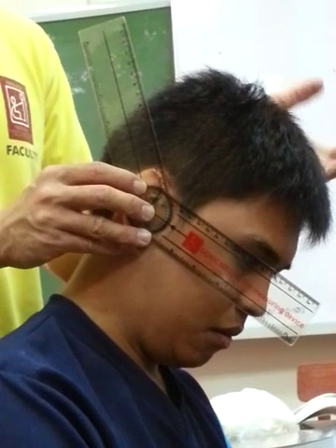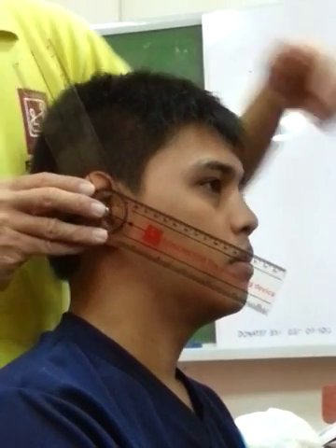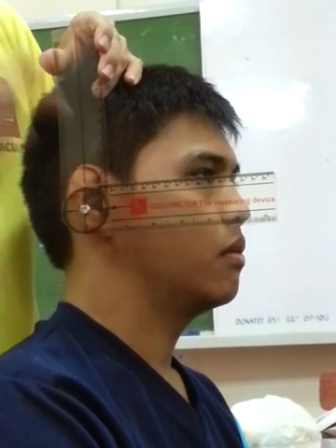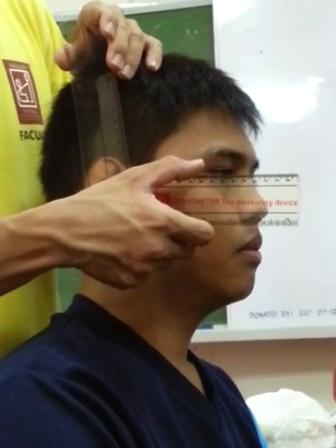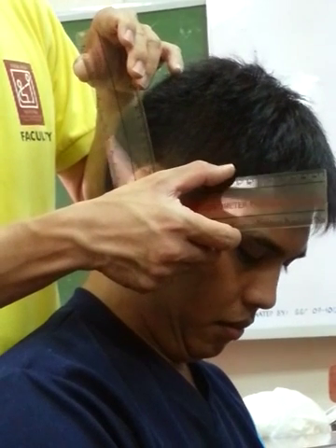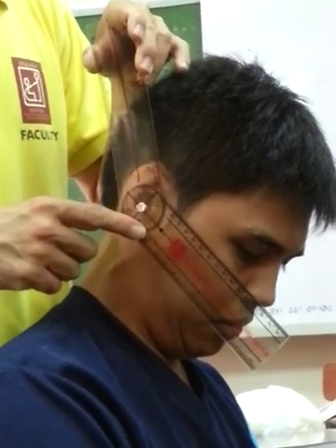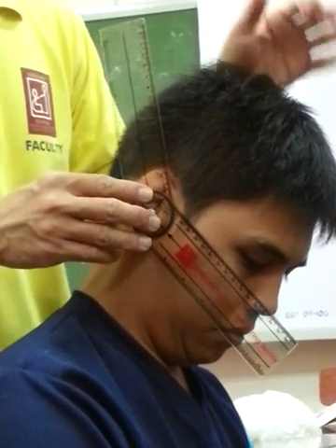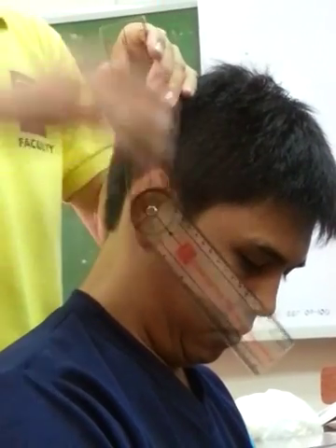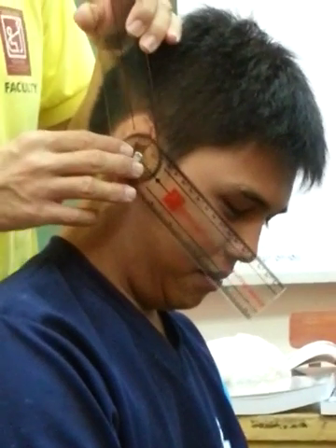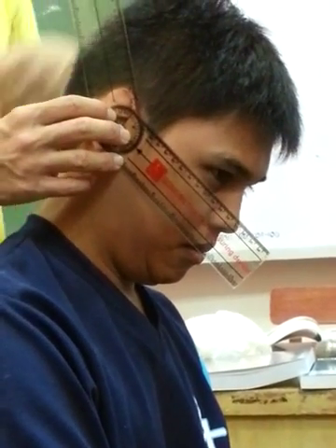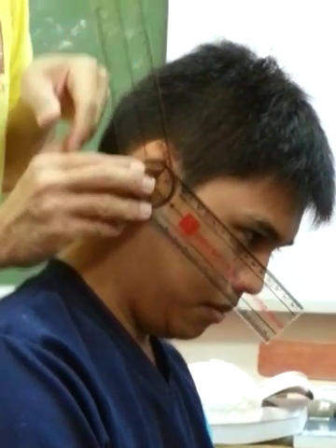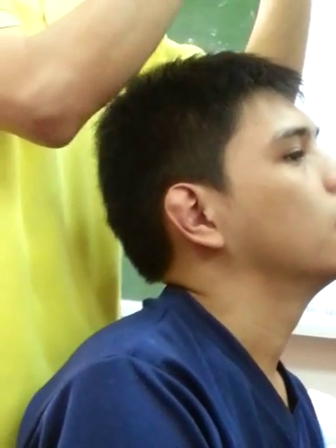There are times when you might tend to move along with the patient. You can position yourself so that you can follow the motion. After the patient bends — 1, 2, 3, bend — you get your goniometer and try to look at the measurement at your eye level. Read the measurement at eye level.